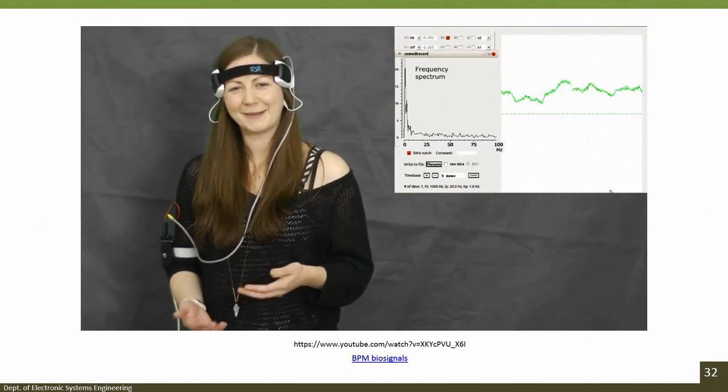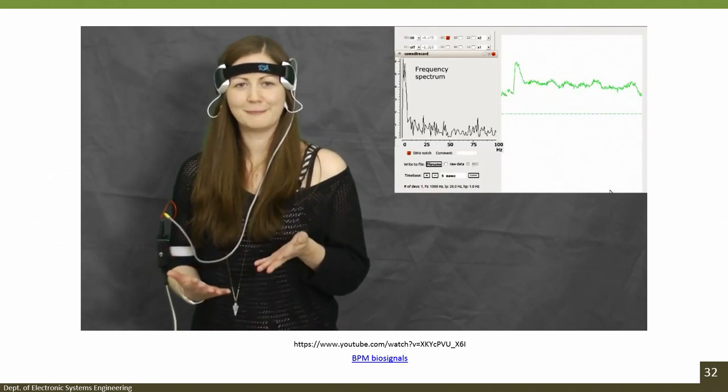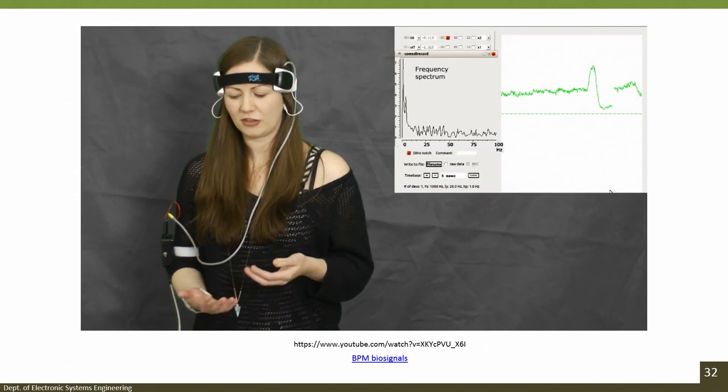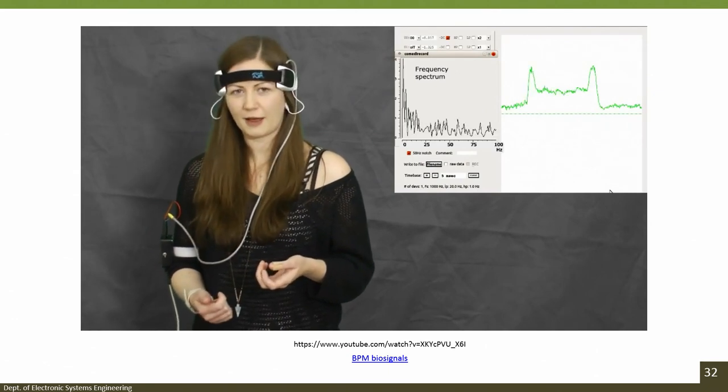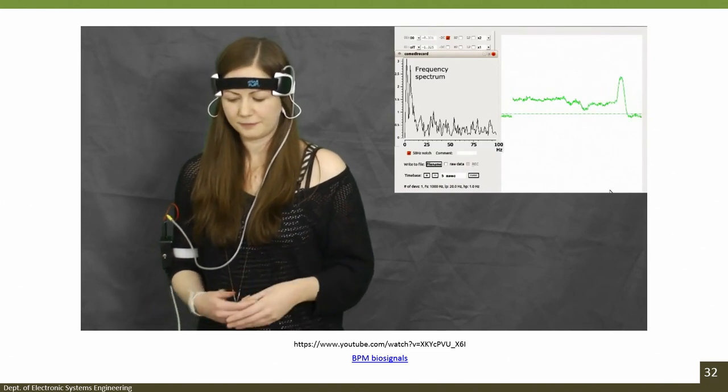working the way they say they are, but it does seem quite obvious that it's very difficult to just measure your brain waves or your EEG without measuring other artifacts as well. And this is all going to have an effect on the output of these devices.